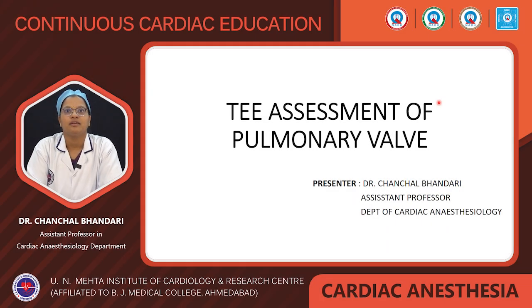I am Dr. Chanchal Bhandari, working as an assistant professor in the Department of Cardiac Anesthesiology at UNMICRC Institute of Cardiology and Research Center, Ahmedabad. Today, we are discussing the topic transesophageal echocardiographic assessment of pulmonary valve.